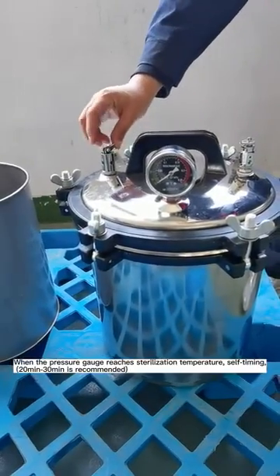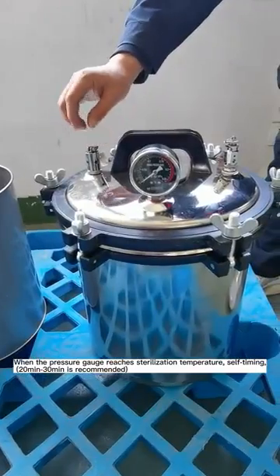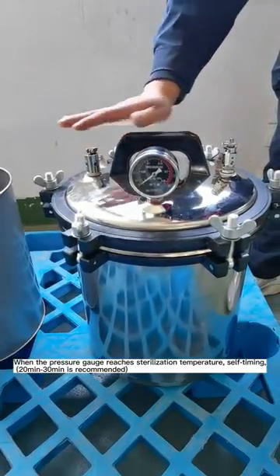When the pressure gauge reaches the sterilization temperature, begin self-timing. 30 minutes is recommended.